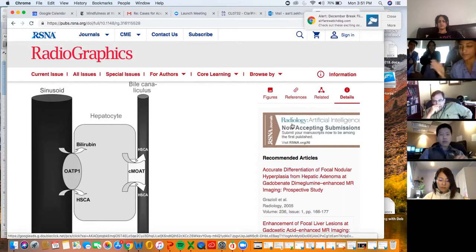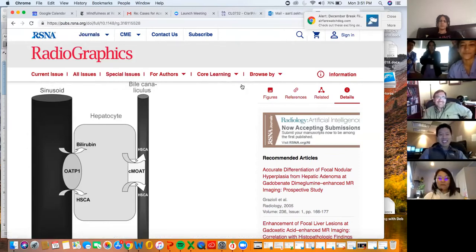And by the time the patient comes to him and he gives general anesthesia and a beautiful breath hold, he usually finds a lot more lesions than we saw in our traditional scan. So then our surgeons were asking us, hey, can't we do this for everybody? And we're like, no, we can't give everybody general anesthesia and do a multi-hour long scan, but it definitely does pick up more lesions.